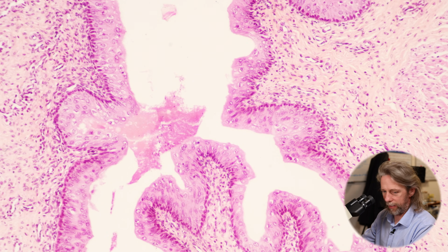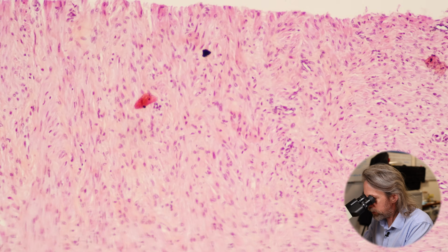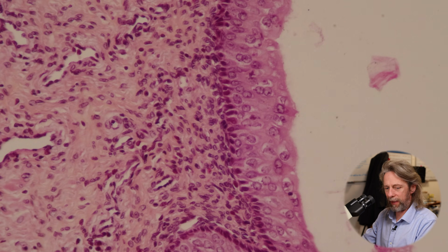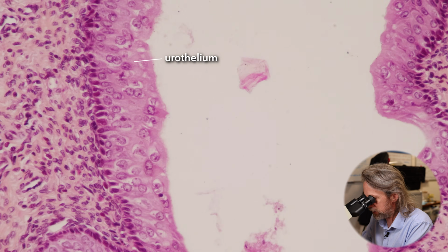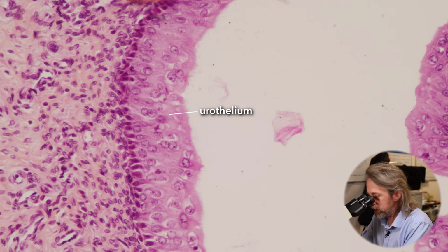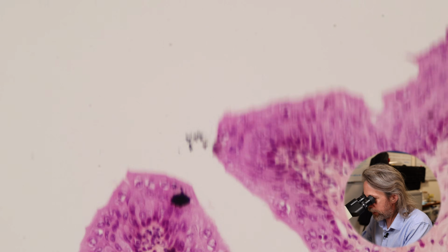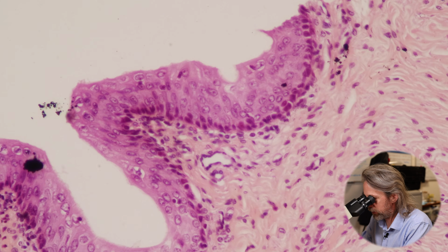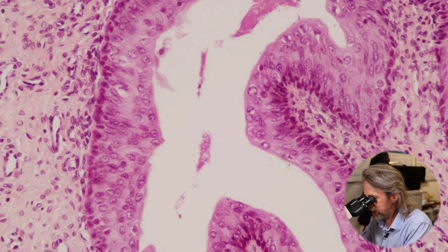see if this is the urethra. Oh yes. Is that too bright for you? Yeah, look at that. Super wiggly, nice muscular tube again, but it's this epithelium that gives it away. That's quite a different looking epithelium. This is a nice section, it's well stained. It looks like we've got lots of layers there, and often the topmost layer, the cells look domed. This is a urothelium. Yeah, that's a urothelium. So that is the urethra.